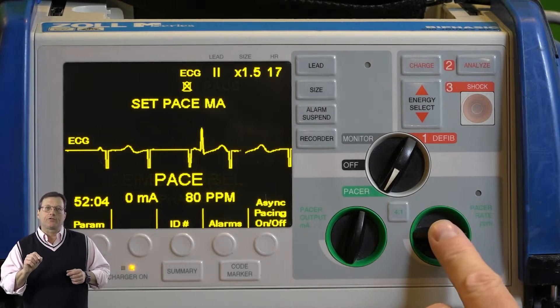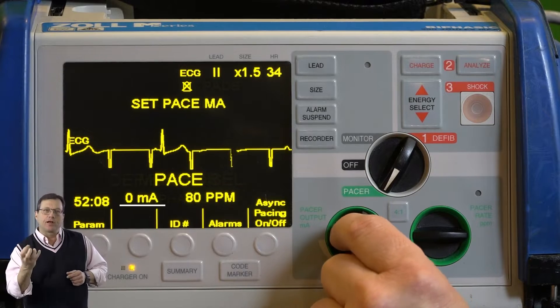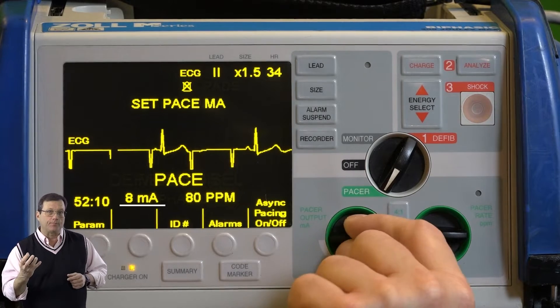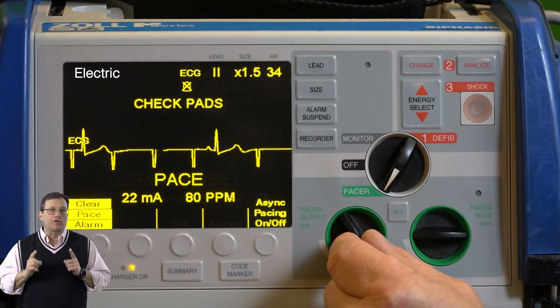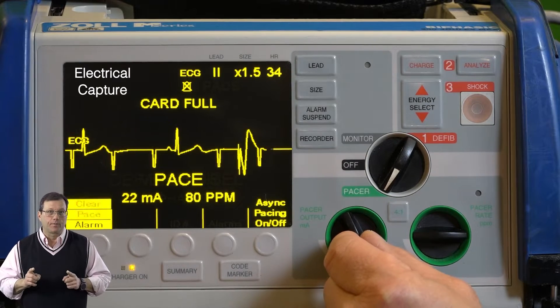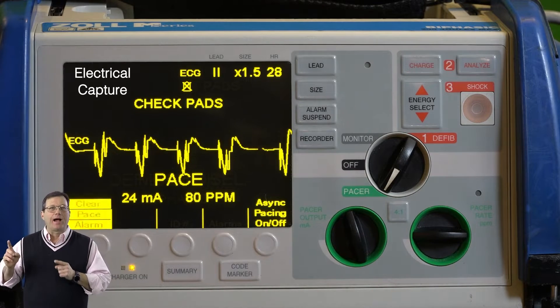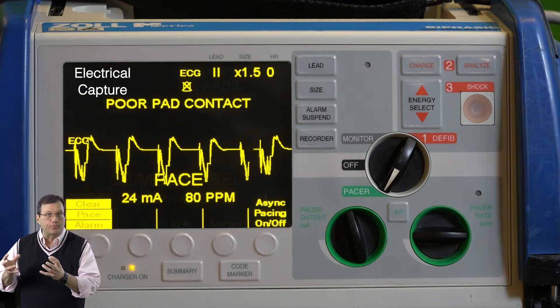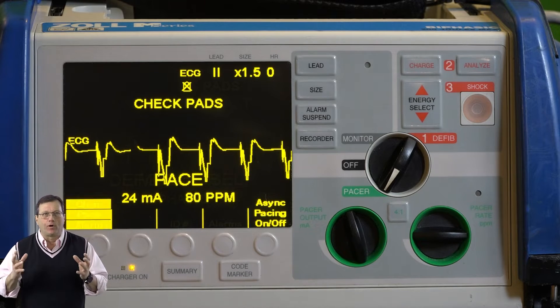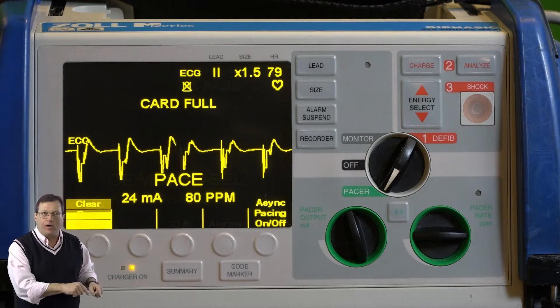Next, slowly start to turn up the milliamps — you'll see the mA on the monitor, which represents the electrical current being delivered to the patient. Keep increasing the milliamps until you see electrical capture on the monitor. Electrical capture appears as a pacer spike followed by a wide QRS complex.